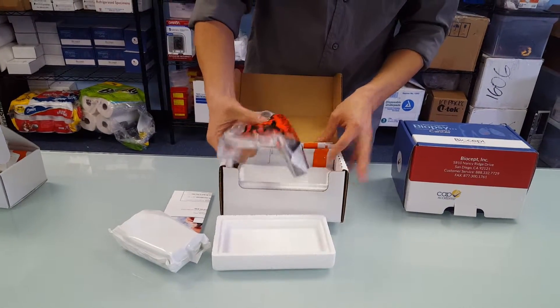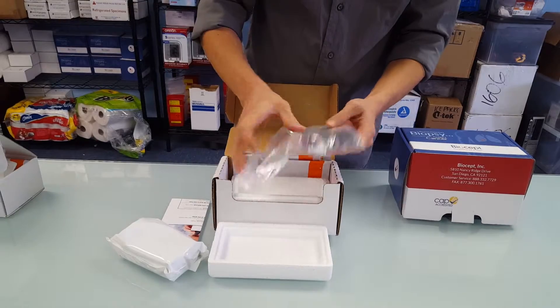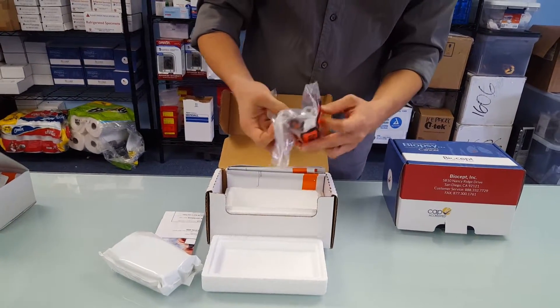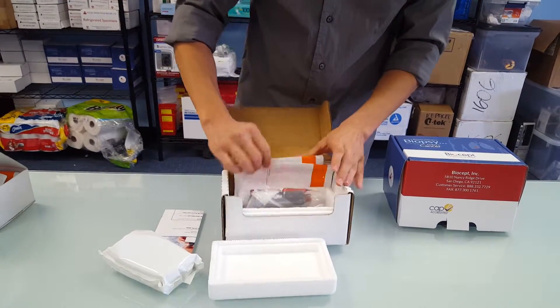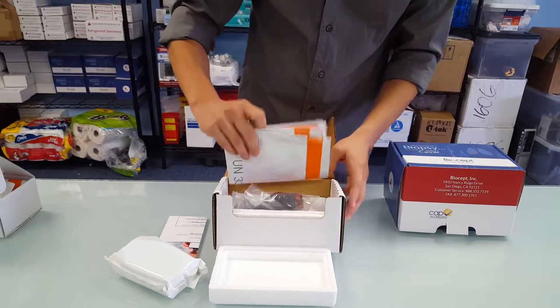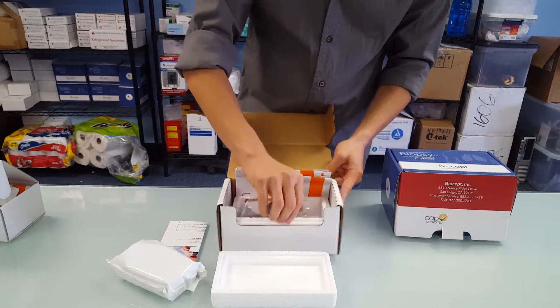It has the biohazard bag pre-loaded with the tubes, and this is a nice foam insulator and holder for the tubes so they don't get damaged. And this, just like the other kit, includes the FedEx return label bag and it should also have the return label in here somewhere.